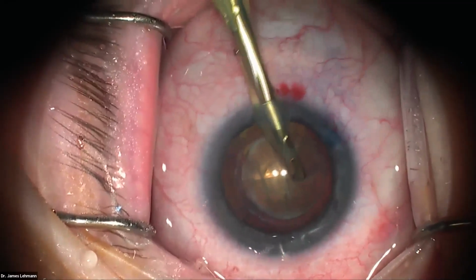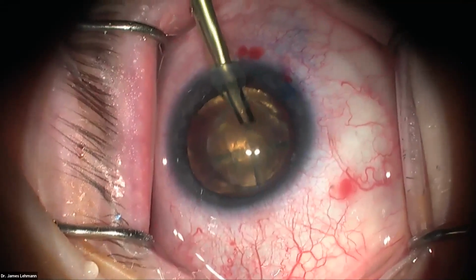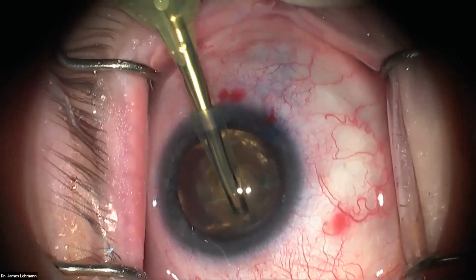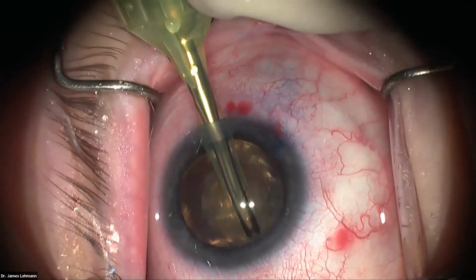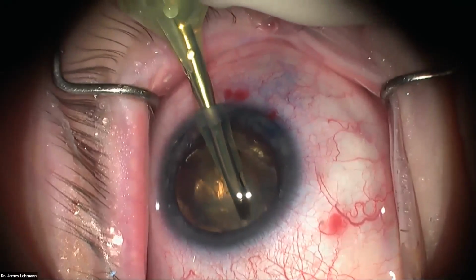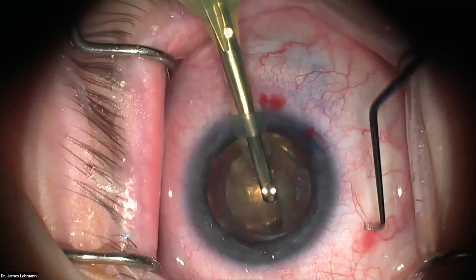Now I went into quadrant mode here, and I'm just clearing up some viscoelastic there to improve the view. And then I'm going to start with my groove under sculpt, which is obviously low vacuum and kind of high power, high infusion. You can start to see the little slices that the laser made, and there's like an internal cylinder there, and then going about 60% there, you can kind of see.